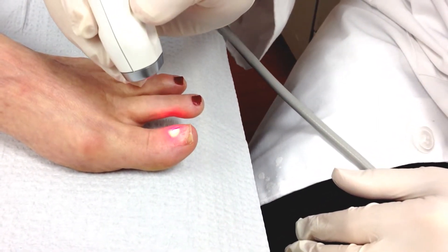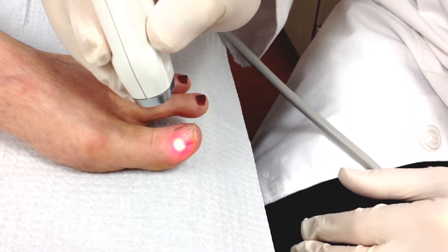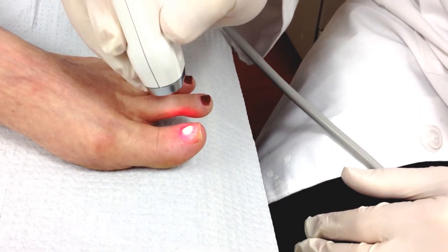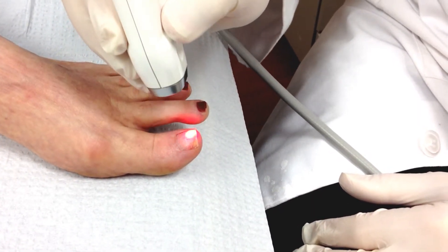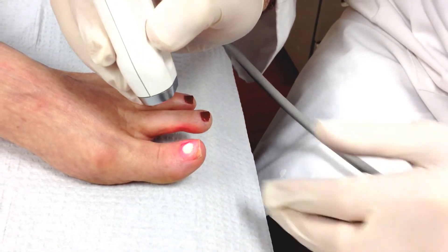So essentially this is how we treat it. We cover the entire surface of the nail, and the laser penetrates the nail plate and treats the nail bed. The patient reports they can feel it, but it's not really painful.